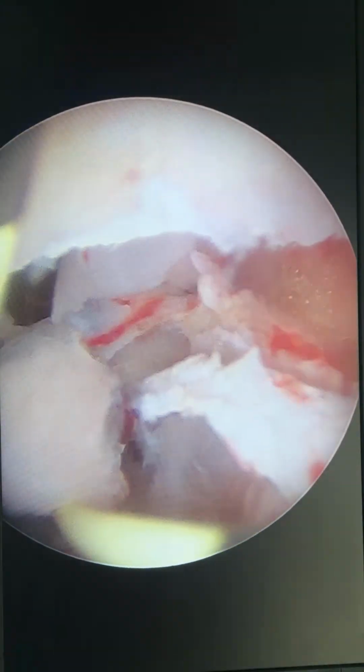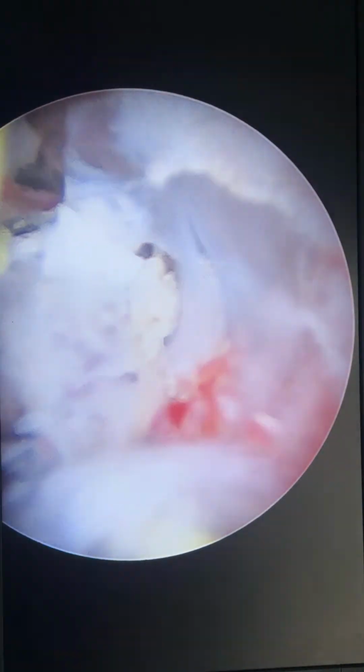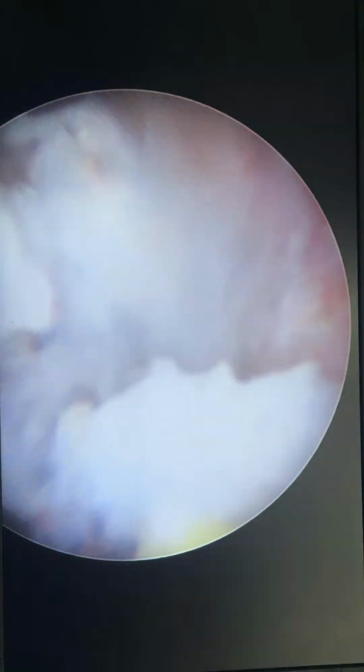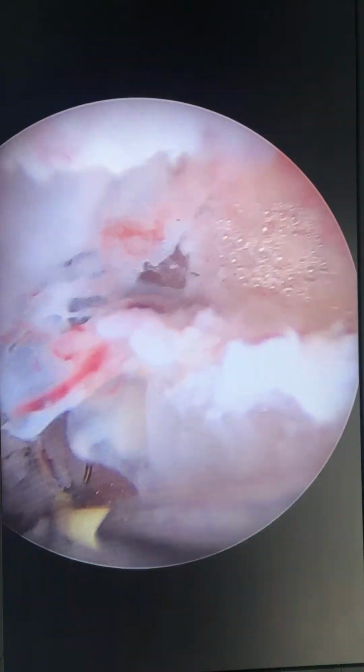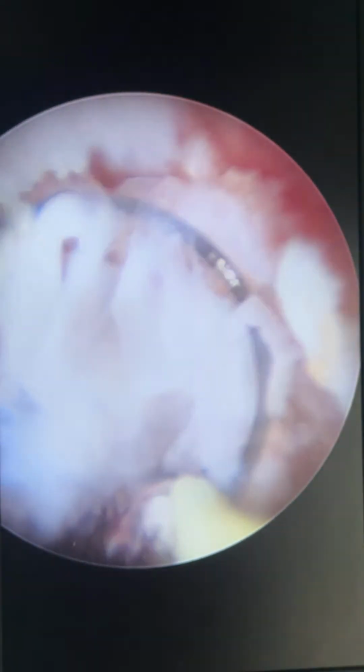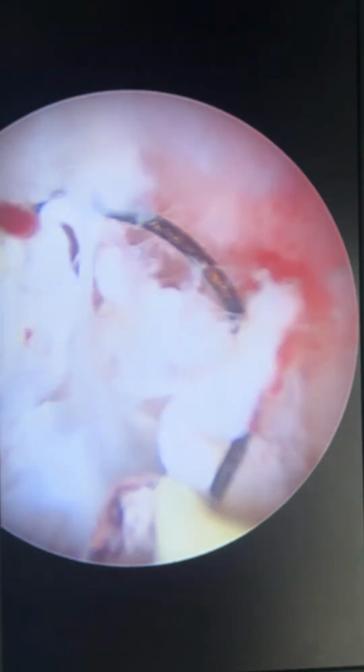So have you given any lessons? We usually, since I'm using a monopolar, the anesthetist is very vigilant, keeping a check on the inflow, outflow, looking at the patient's vitals. So in hysteroscopic surgery, it's very important that it's a very sophisticated teamwork. The fluid management, keeping a check on the inflow, outflow. So everything goes hand in hand for a safe surgery.